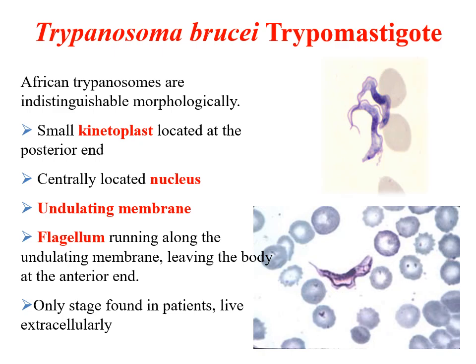Let me start showing you some pictures of trypomastigotes of African trypanosomes, which are Trypanosoma brucei, whether gambiense or rhodesiense. As you can see, these trypomastigotes have this undulating membrane that has the flagellum covering the full surface of the stage. You cannot distinguish between trypomastigotes of brucei gambiense or those of brucei rhodesiense.